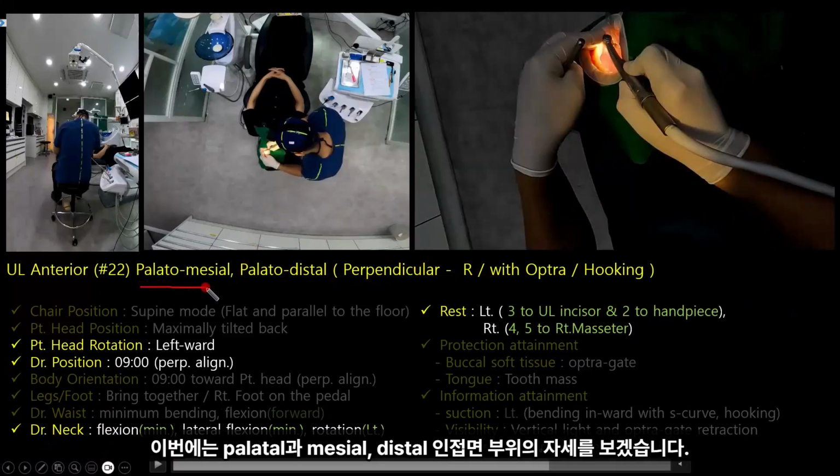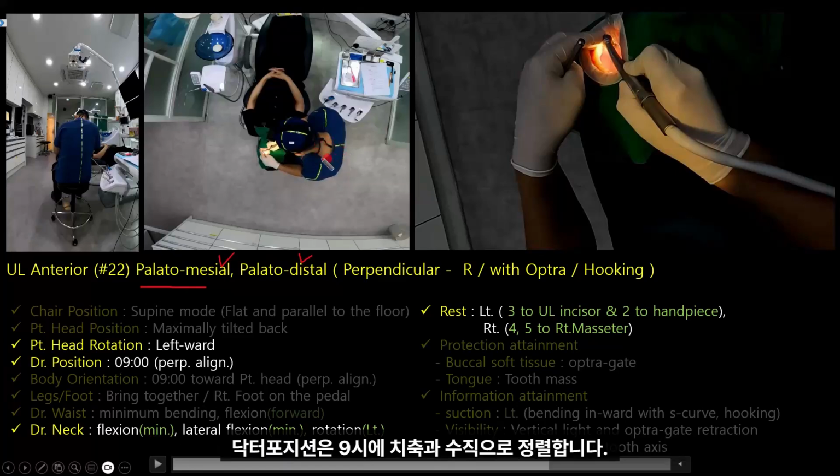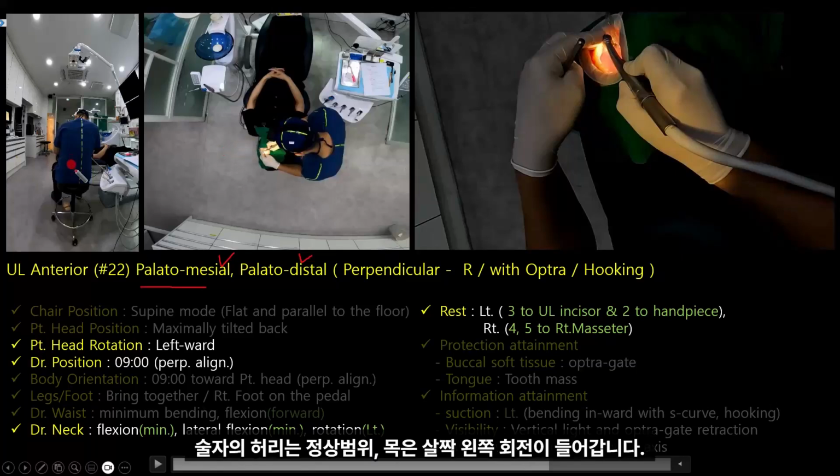This time, let's look at the posture for the palatal, mesial, and distal adjacent surfaces. The doctor's position is at 9 o'clock, aligned perpendicular to the tooth axis. Tooth axis direction this way, operator body orientation this way, aligned perpendicularly. To secure the line of sight, the patient's head is rotated as far left as possible, according to the doctor's position at around 9 o'clock, rotate left. The operator's back is within the normal range, and the neck is slightly rotated to the left.